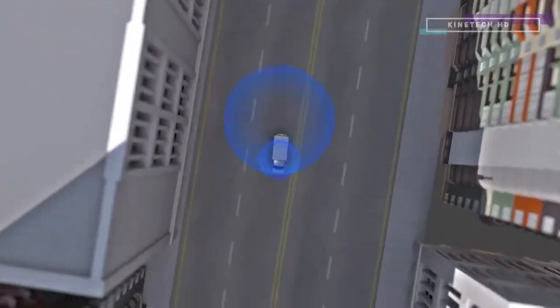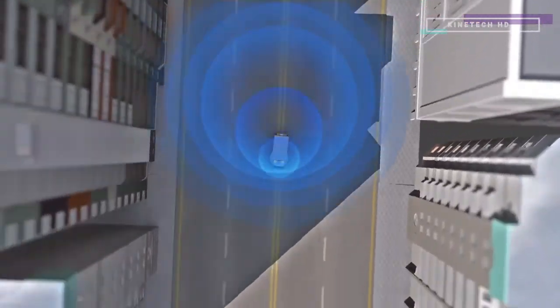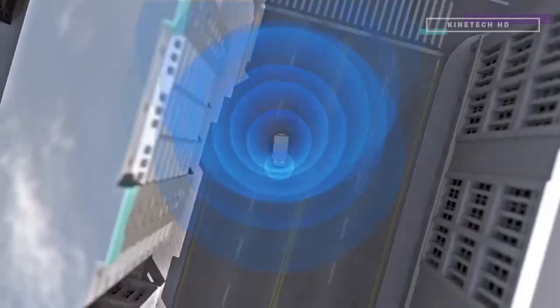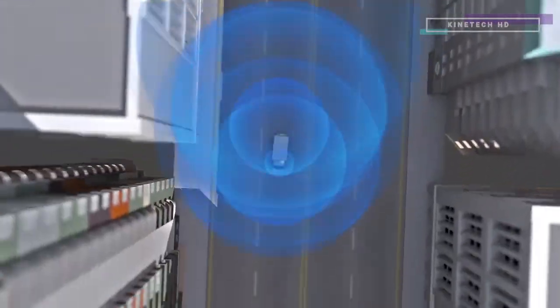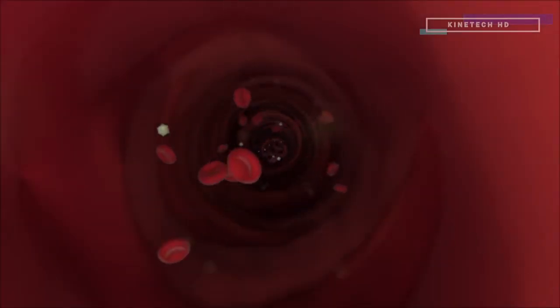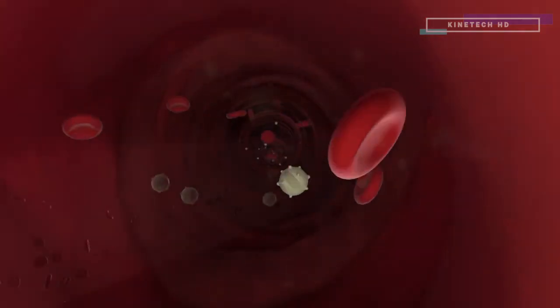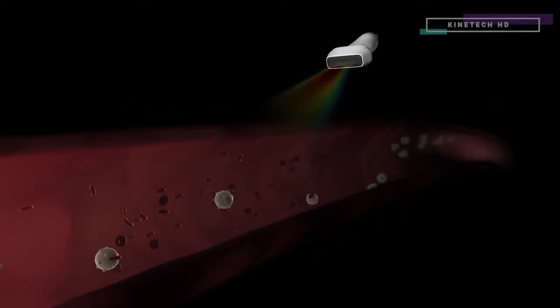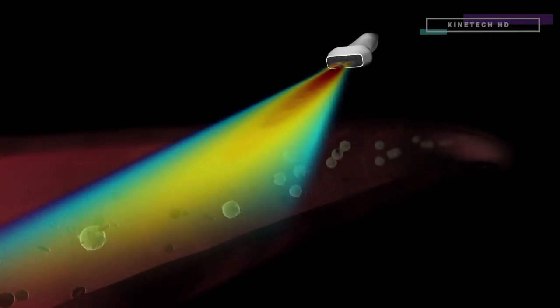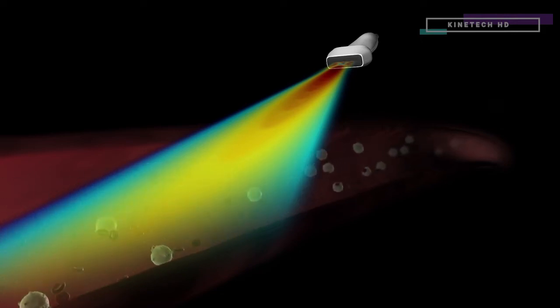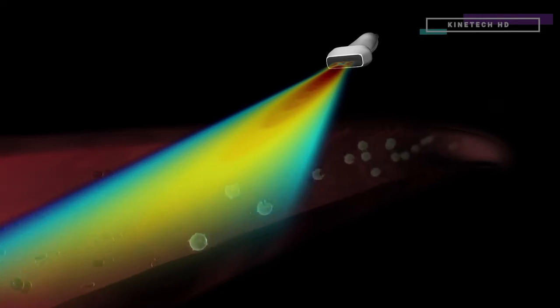The waveform is compressed as the ambulance approaches, making it sound higher pitched, and it's stretched as the ambulance departs, making it sound lower. Doppler ultrasound uses the same principle to determine the speed and direction of the blood inside your arteries. The transducer is held at an angle to the blood vessel, and the altered frequency of the echo returning to the transducer from the blood flow tells the computer the blood's speed and direction.